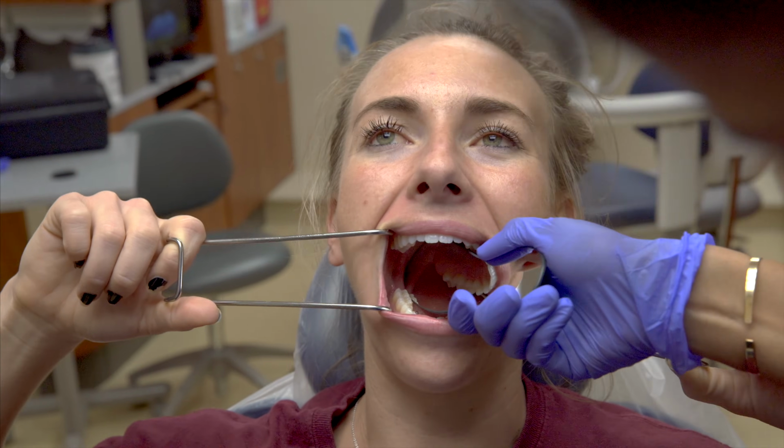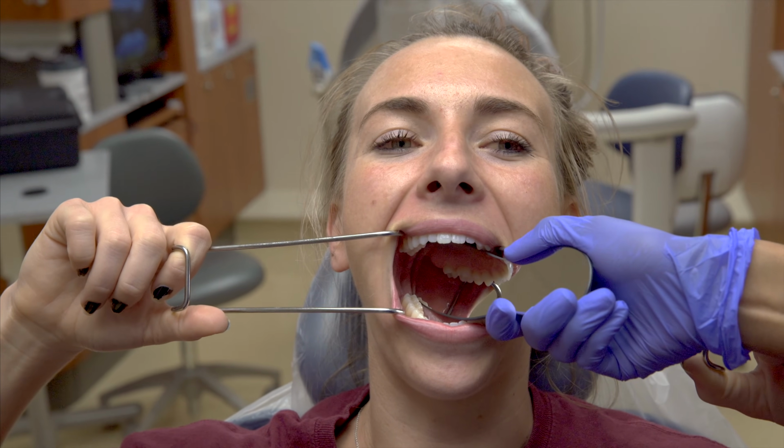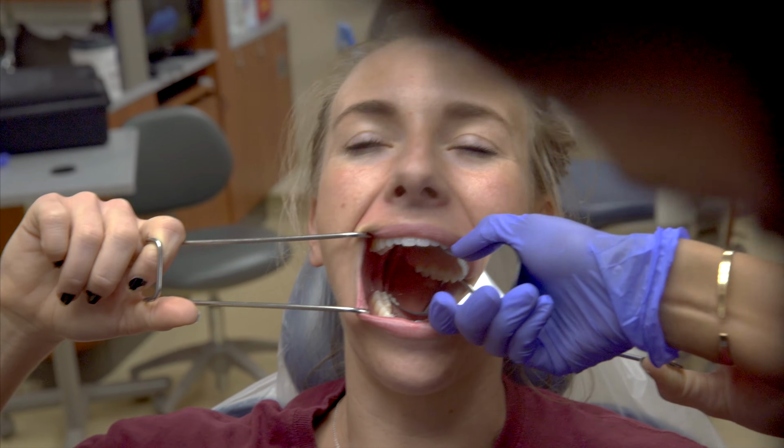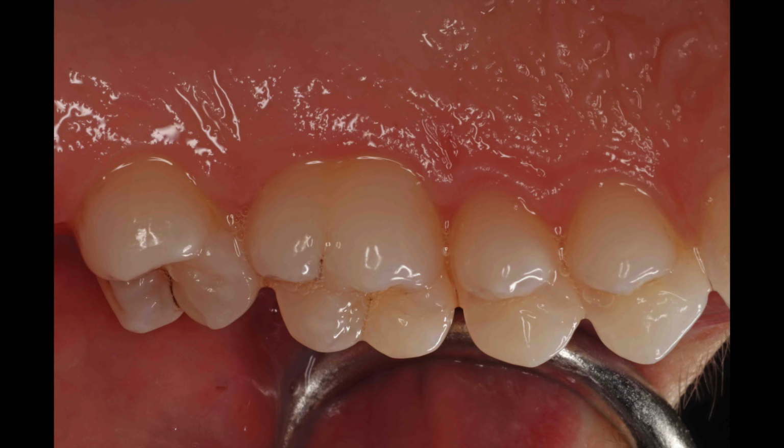Here, the assistant was using the opposite end of the mirror for demonstration. However, I prefer the more rounded end, which seems to fit into the palatal vault a bit better. This photo is good. You can't help seeing the retractor in the background unless you use tissue blockers, which we will touch on briefly at the end.